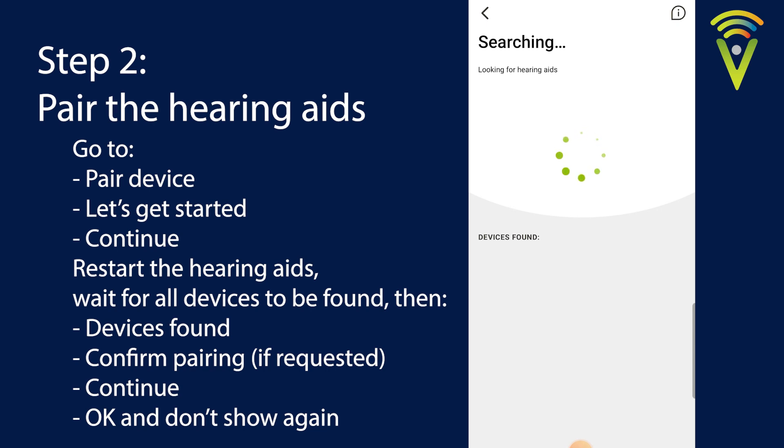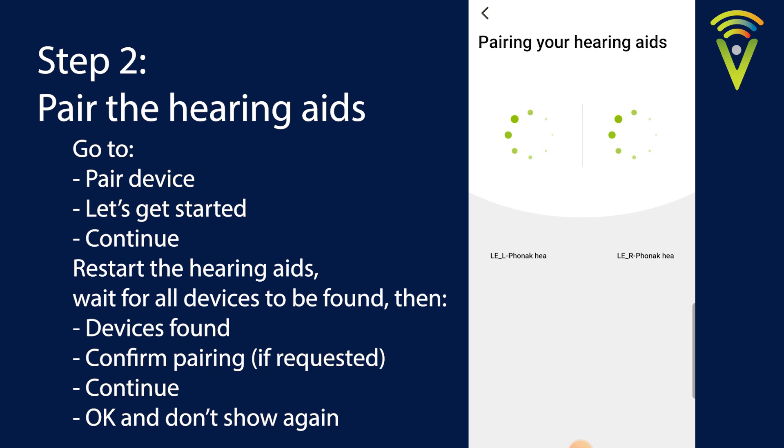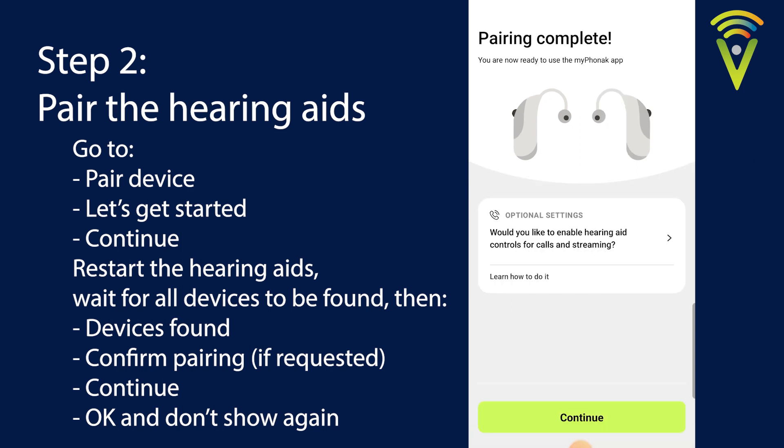Once they're back on they should pop up on the screen. It's found the left one, and we're waiting for it to find both hearing aids — we want them both in the same square, so you can see LEL and LER. Select that and it'll ask you to pair. It'll ask for permission to pair these hearing aids twice, once for each aid. Sometimes it will prompt you and you'll just confirm by clicking Pair twice. Then hit Continue.